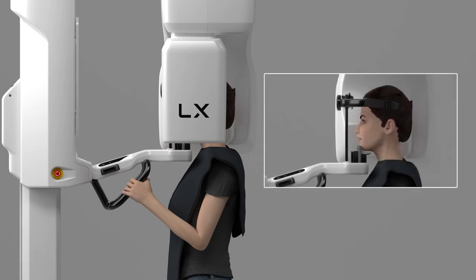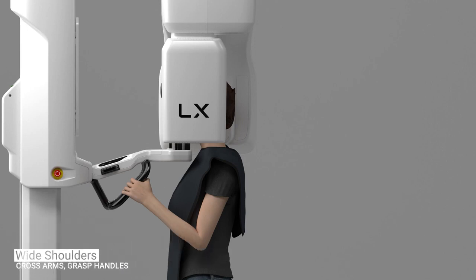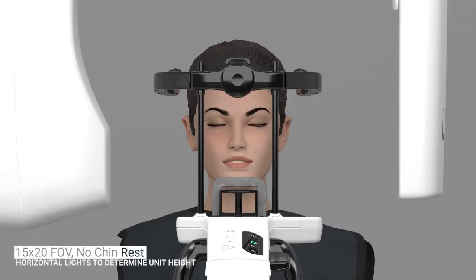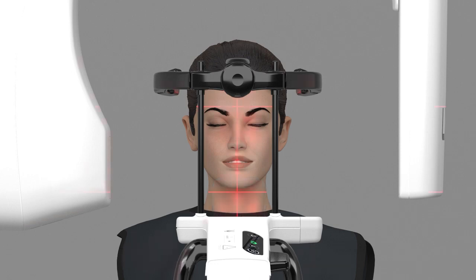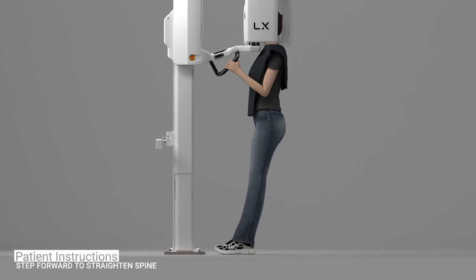If the patient has wide shoulders that could collide with the rotating unit, ask the patient to cross their arms when holding the handles to contract the shoulders. If you are taking a 15 by 20 field of view image without a chin rest, use the horizontal lights to determine the correct height for the head support and patient's head. Ask the patient to take a step forward to straighten their spine.